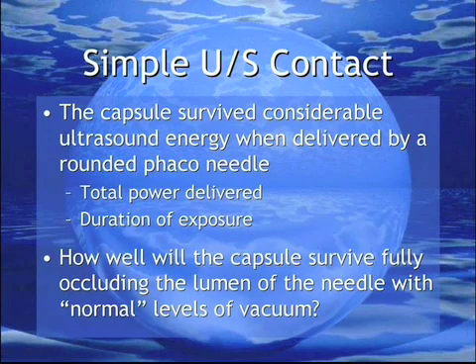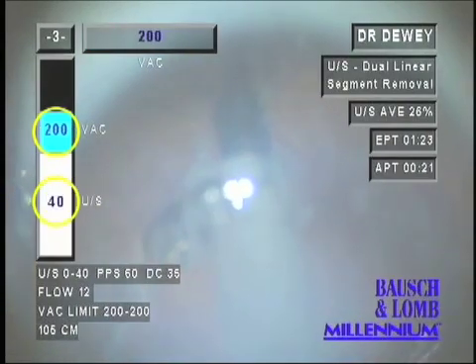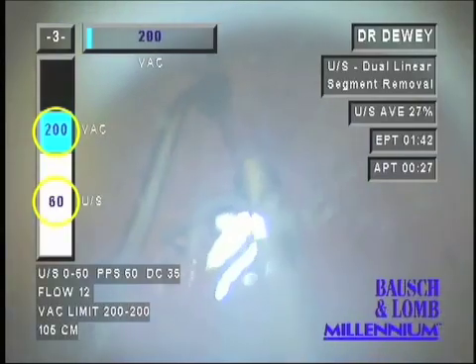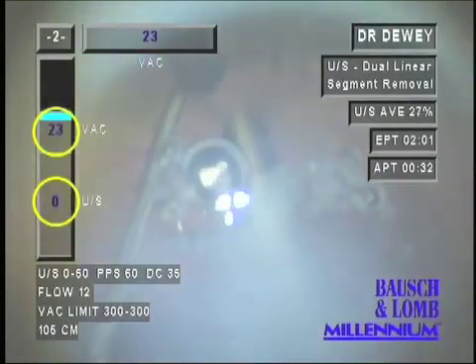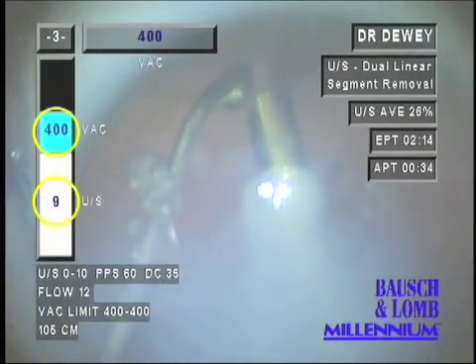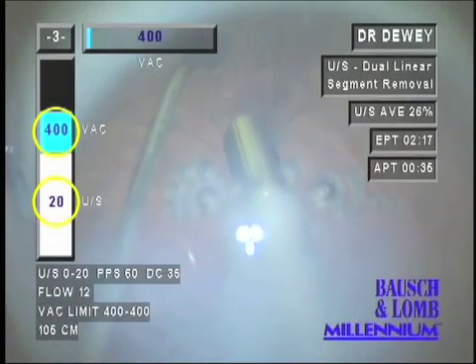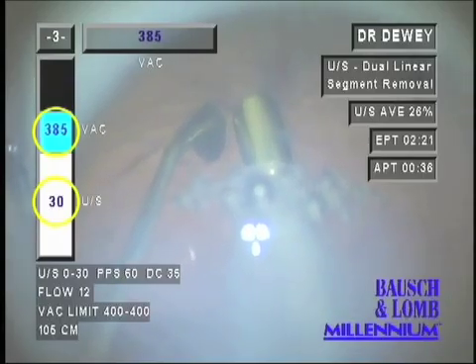But what of normal levels of vacuum and power seen while removing a cataract? What about occlusion? I have held this example in reserve as this capsule exceeded any expectations of the study. Presented here is a 48-second edit of the 17 minutes it took to break this capsule. By this time, myself, Drs. Nick Mamelis and Liliana Werner were becoming relatively familiar with the capsule's surviving ultrasound applied with a rounded FACO needle, but no one expected any capsule to survive to this extent. The needle was repeatedly applied to the only area visible through the clouded cornea. The integrity of the capsule and zonules was first tested at 400 mmHg with no power. Then, power and vacuum were reset to low levels and increased incrementally. Various combinations were explored until we reached 400 mmHg and the capsule finally ruptured at 50% power.